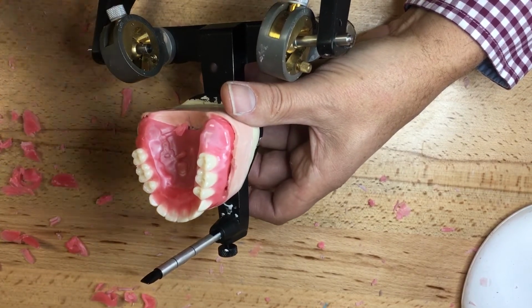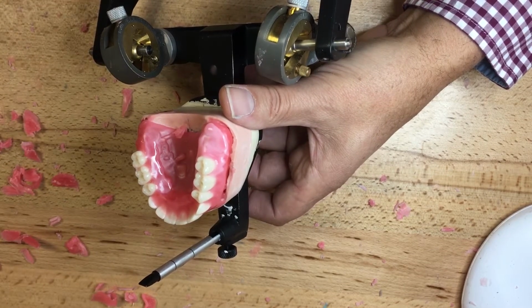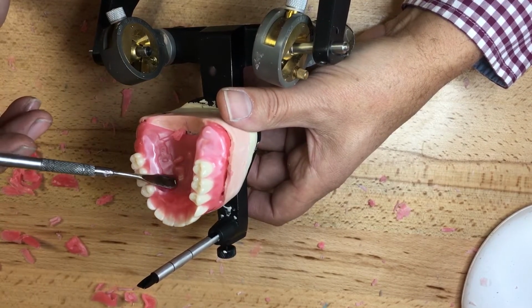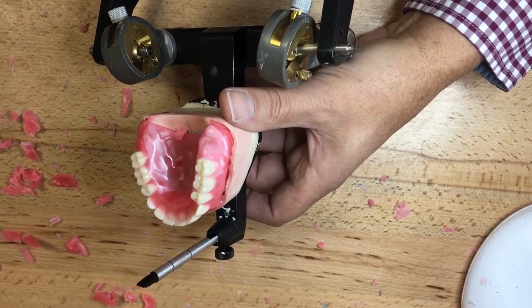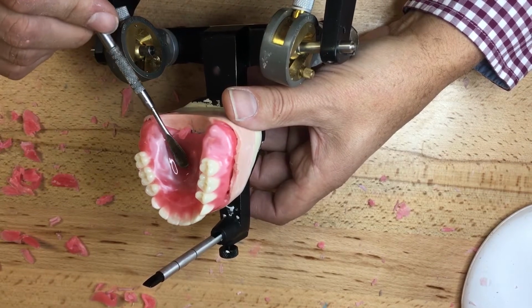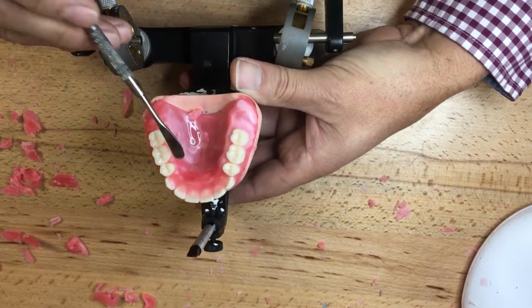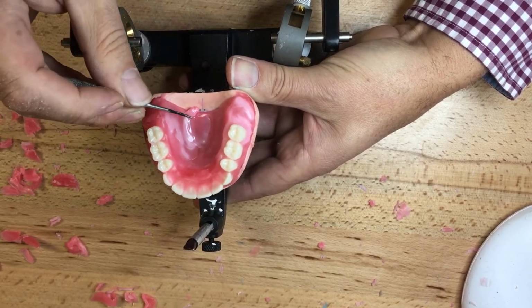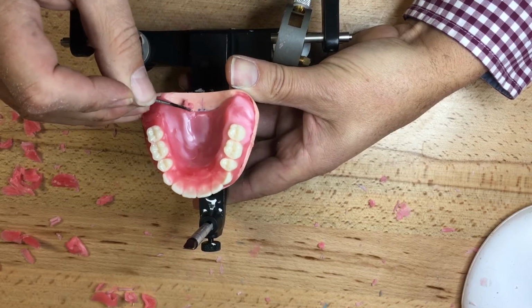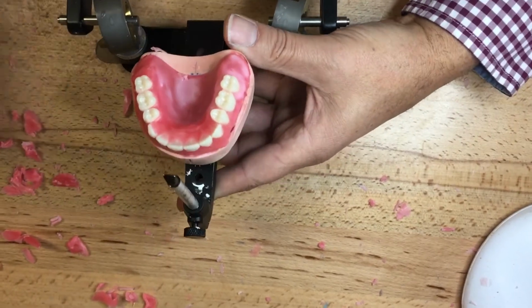If you take postgraduate denture setup courses, they'll say, well, can I get 1 cusp, 2 cusps, 3 cusps? I'm thinking as many as we can. And if we can't achieve them all with the denture manufacturer's tooth form shape, then we'll have to anticipate doing it with a handpiece, and cleverly manipulating the shapes of the denture teeth to achieve the group function.